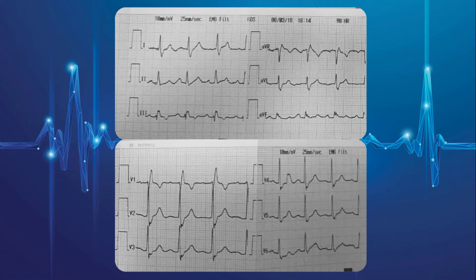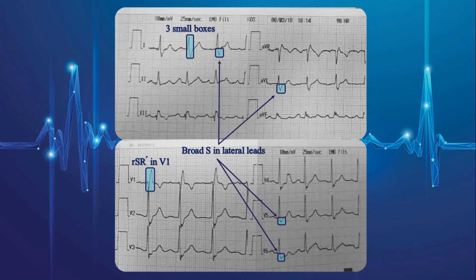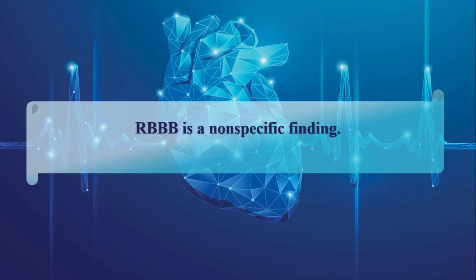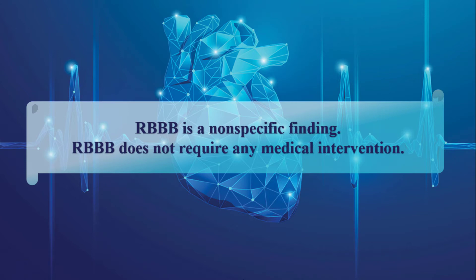Duration of QRS complexes is three small squares, so the complexes are wide. Furthermore, there is RSR prime pattern in V1, in association with broad S wave in lateral leads, which establishes RBBB as the cause of QRS changes in the present strip. Even under pathologic conditions, RBBB is a nonspecific finding and may be caused by a number of factors. So RBBB does not have any specific treatment and does not require any medical intervention.